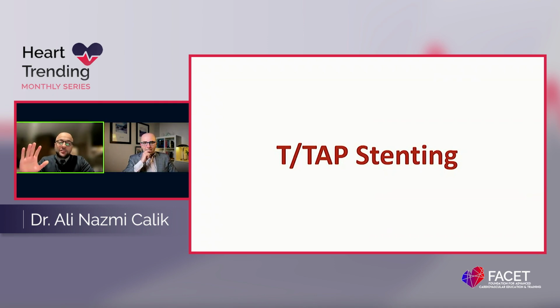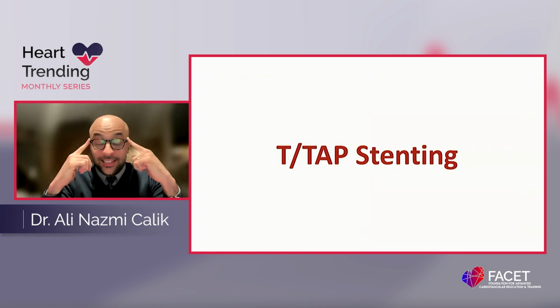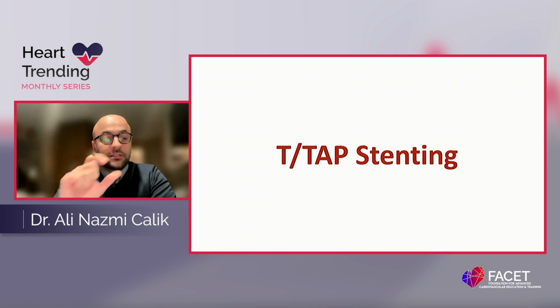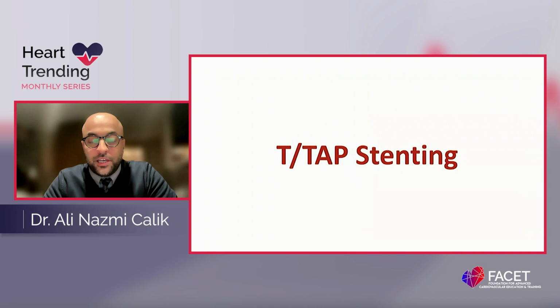So with a bifurcation, if you decide to treat a patient with bifurcation stenting, always put 2 guide wires. Always. This is rule number 1. I see some cases in the current literature where they put the first stent from the left main to the LAD without a wire in the circ. And when I asked the operator why didn't you put the second guide wire? Because the circ ostium is wide enough. No, this is not a reasonable answer. Anything can happen. Yeah, a lifesaver. Anything can happen during bifurcation stenting.